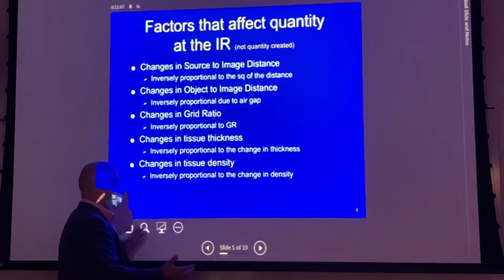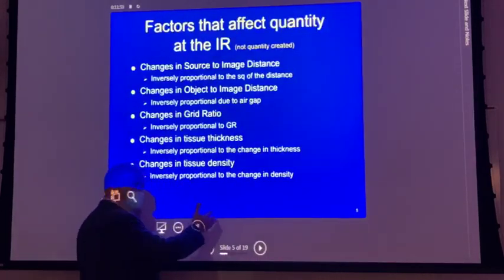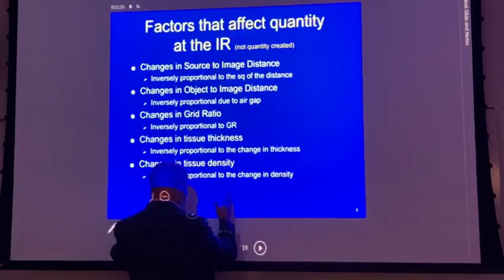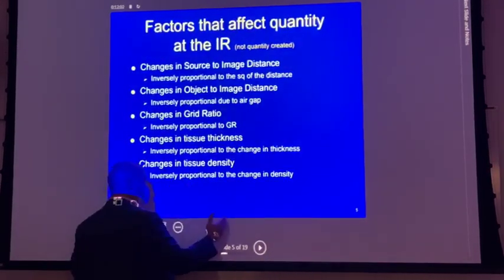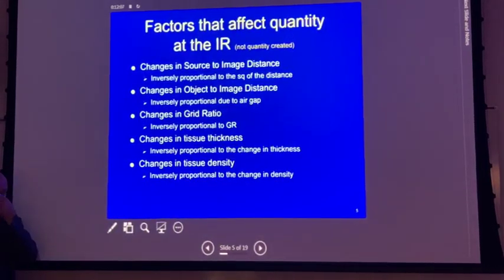So as you back up that distance, you have to beam restrict, right? So you take all that light and you spread it out, and then you just use a fraction of that light, right? The X-ray is the same thing. You spread it all out, but you just use a portion of it. So your intensity in just that area for a chest X-ray is going to reduce drastically, right? Since that intensity, those numbers drop, then what do we have to do with our technique? Increase our technique, right? So we'll talk about all that for the next test.